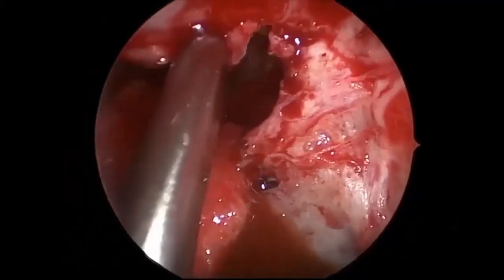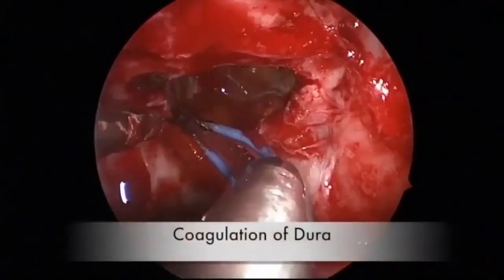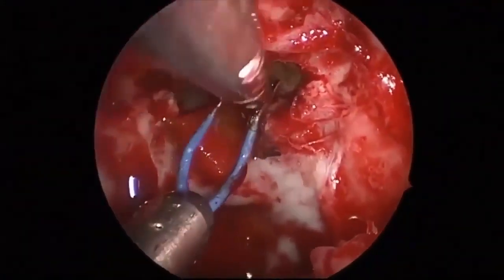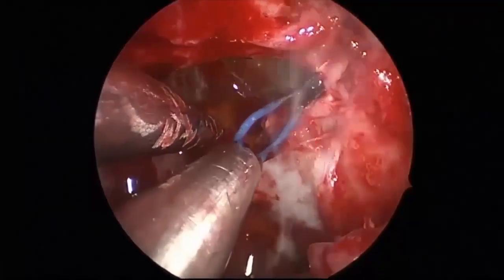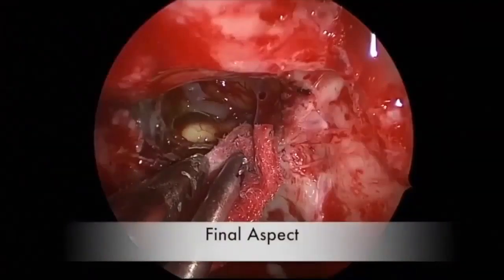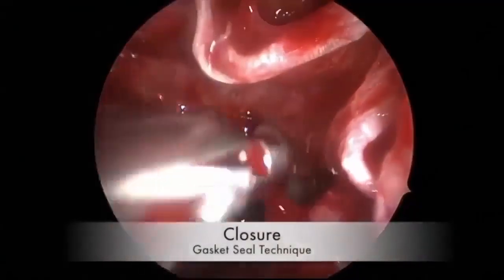Additional dura is removed along the planum in order to get the dural tail of the tumor, which is also cauterized. The lateral aspects of the dura over the carotid artery is cauterized to fulgurate the tumor, to try to kill any residual microscopic cells that may be left behind. The optic chiasm is identified, which is well vascularized.